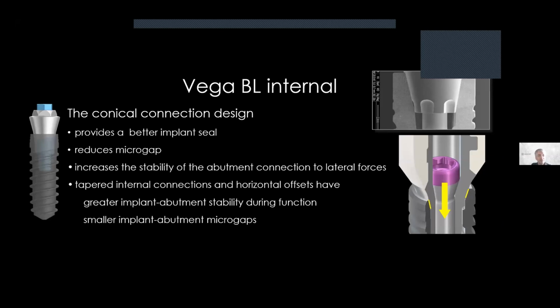And what we know is that when we chew, those forces get inside the implant through the abutment, not through the screw. The screw is just a stabilization piece. We make the restoration, we put it in the implant, we screw, and even taking out the screw, the restoration will stay in place. It's like a cold welding. But this can be achieved only with original components, not copycats. We have to mill in the correct milling centers. Otherwise, we will lose all this kind of setting and this kind of friction.